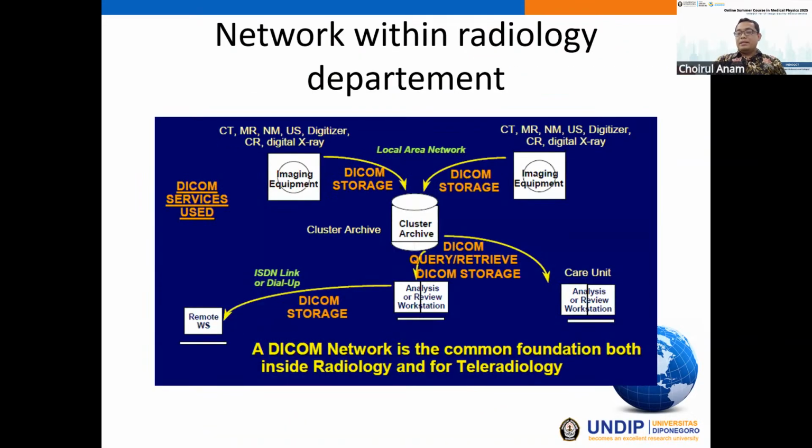Okay, the DICOM format is very crucial in the network within the radiology department. We can see here the imaging equipment such as CT, MR, CR, US, and so many other modalities in the hospital, and they can be connected to each other.